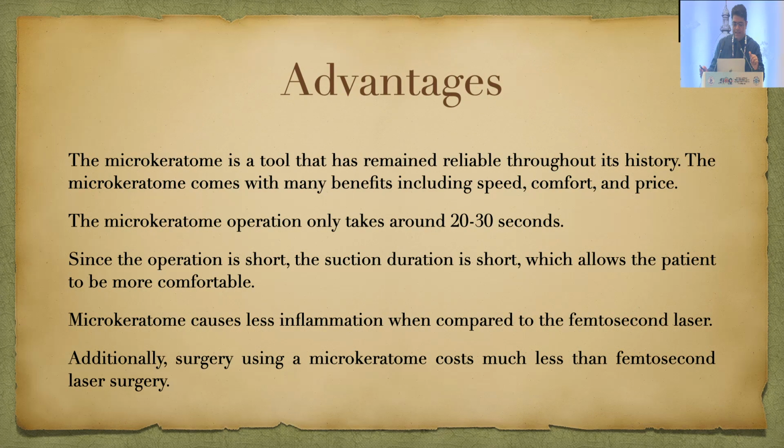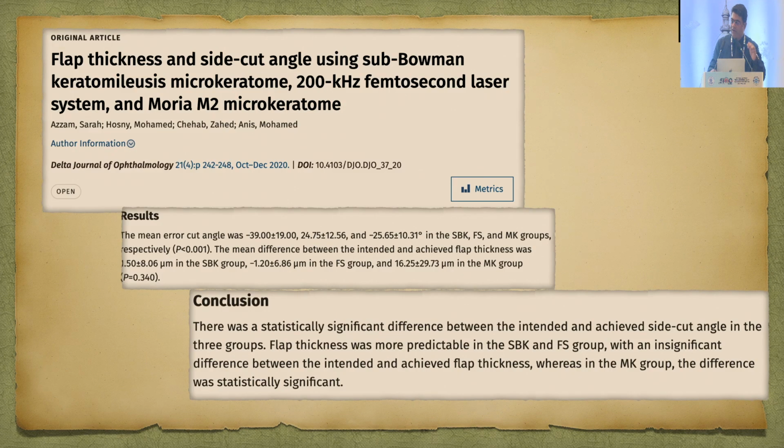So the advantages of microkeratome, as I said, is that the operation only takes 20 to 30 seconds as compared to femtosecond laser, which takes a longer time. And because the operation time is short, suction duration is short, it allows the patient to be more comfortable. And moreover, microkeratome LASIK causes less inflammation as compared to femtosecond laser. Chances of DLK are less in microkeratome. And of course, it costs much less than femtosecond laser.